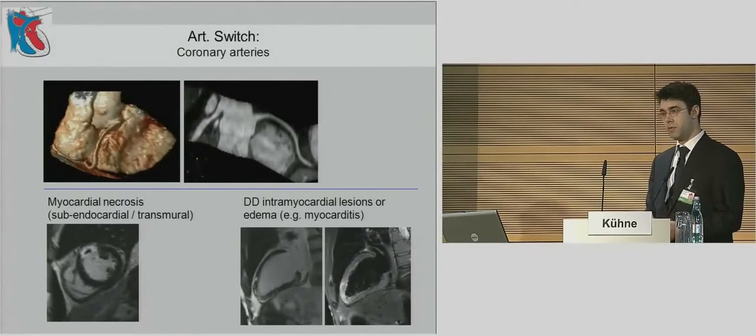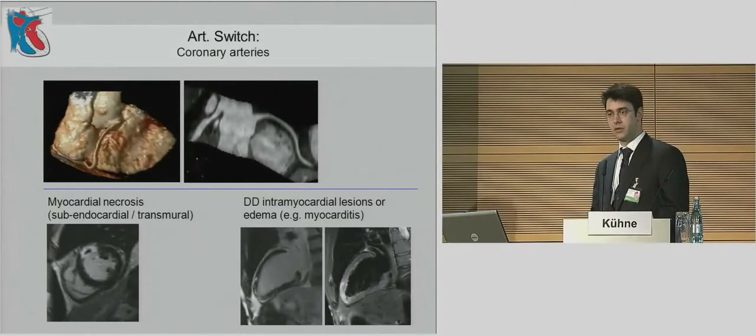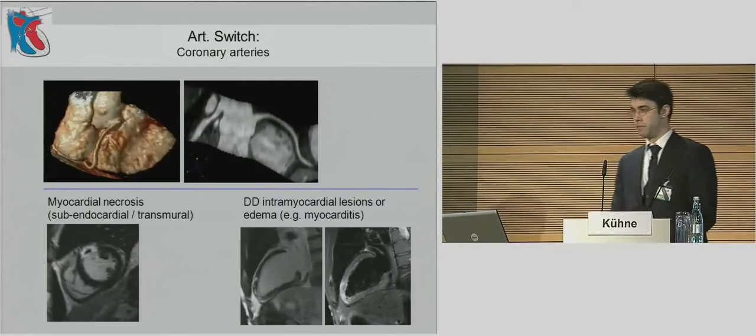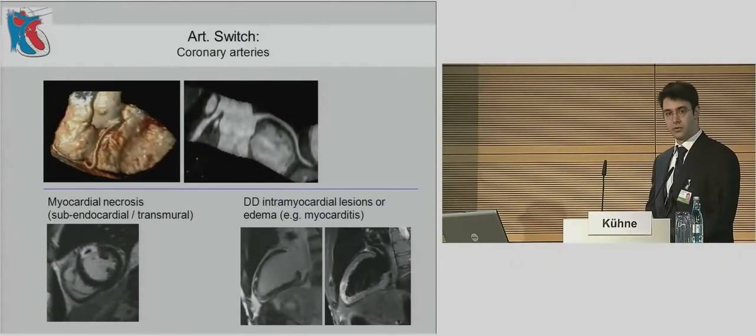Yesterday, the question from Mr. Shakureshi was, there's a 20-year-old woman presenting to the physician after switch, and she wants to do sports. What are you doing? Okay, what can I do? I can visualize the coronary arteries. I can do that also in follow-up.